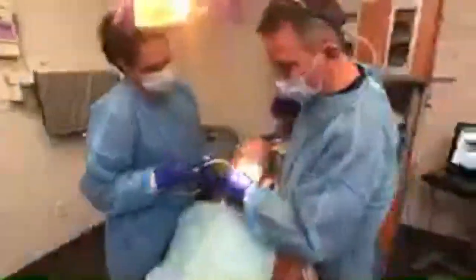A little pressure and you are good to go — no biting because that's my finger and I still need it for tomorrow's patients. Done! Any pain at all? Now we do another x-ray — this is the check x-ray that shows me exactly how great everything looks, and I can confirm that everything was done perfectly. Then we get to go home and call it a night.